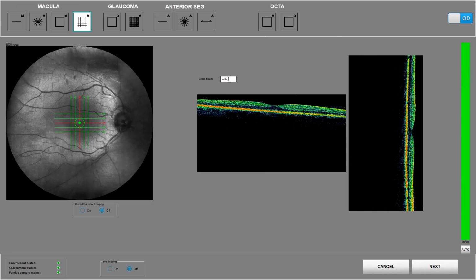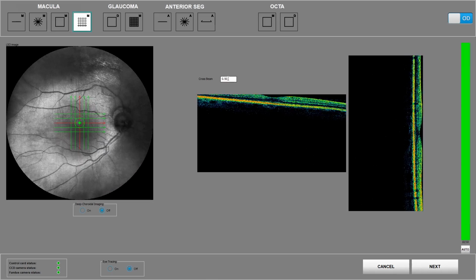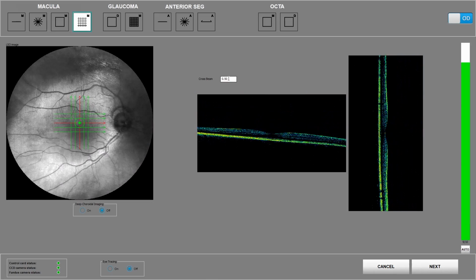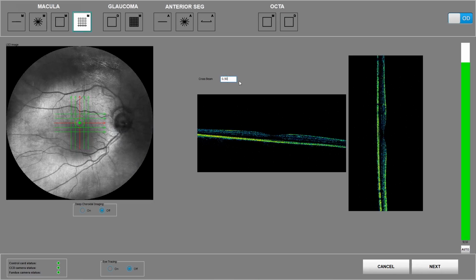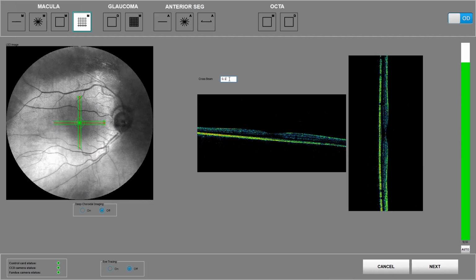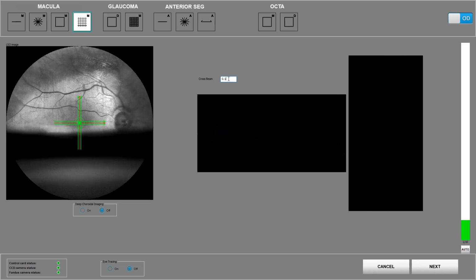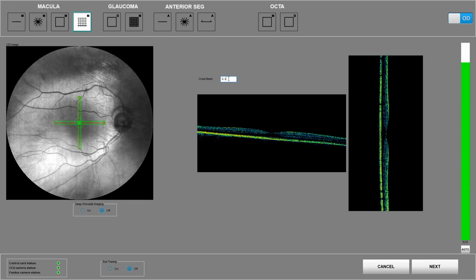For example, you can use, as you can see here, the 50 microns width one from the other, or you can change it to 10 microns, as you see here. And by using this feature, you can go from 1 micron to 200 microns.